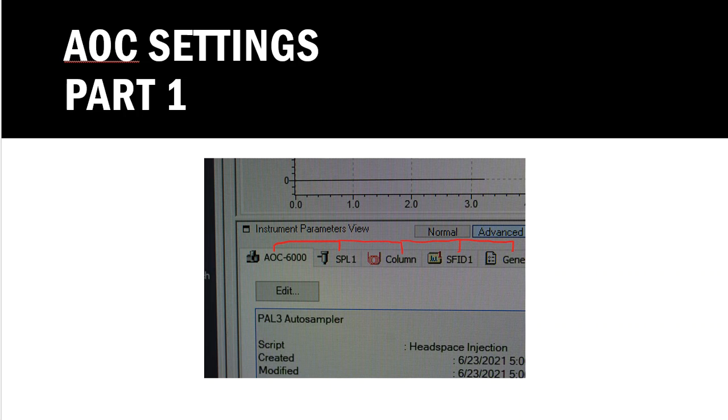And this is what should change, right? So when I open up a method file, these numbers will update in all of these tabs. And I have a habit of just double checking them. I want to make sure that these make sense. I want to make sure that they match the document because I cannot trust anybody. Someone could go in and make a setting change and not know about it maybe, but not tell anybody about it. And if I am the unlucky one, I'm just going to go in and assume everything's ready to go, and it's going to not be.